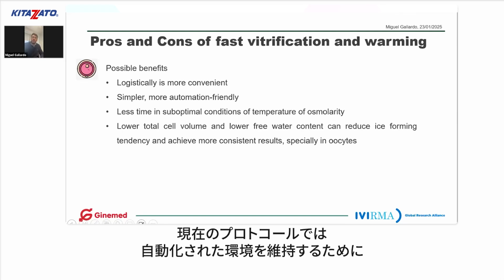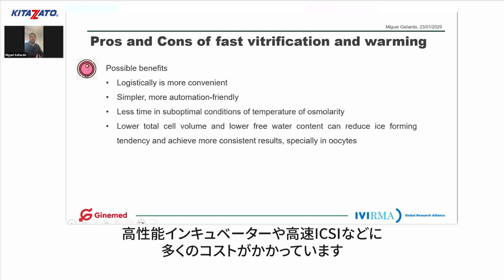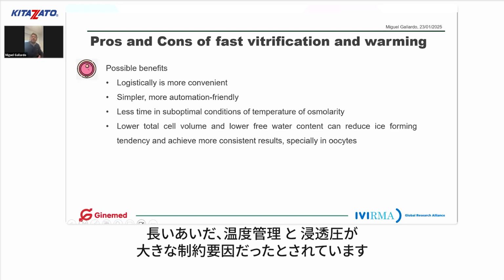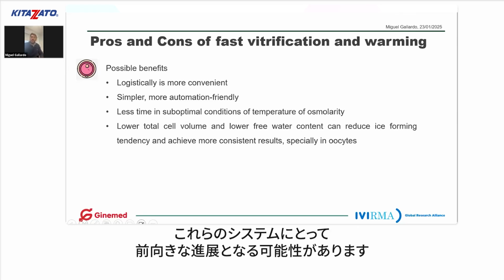The time it is exposed to suboptimal conditions in current protocols, because we spend a lot of money on the best incubators, very fast ICSI, and so on. And then for the cryopreservation, they stay for a very long time in suboptimal temperature and osmolarity. So this reduction probably can be positive for them.